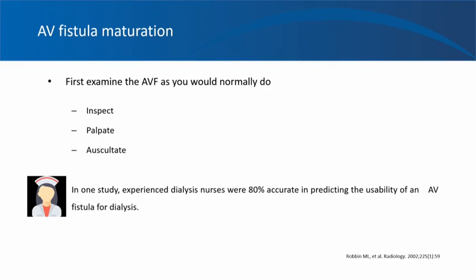Actually, in one study, experienced dialysis nurses were 80% accurate in predicting the usability of AV fistula for dialysis compared to ultrasound evaluation of AV fistula. So whenever you are in doubt, call your dialysis nurse to help you with the AVF examination.